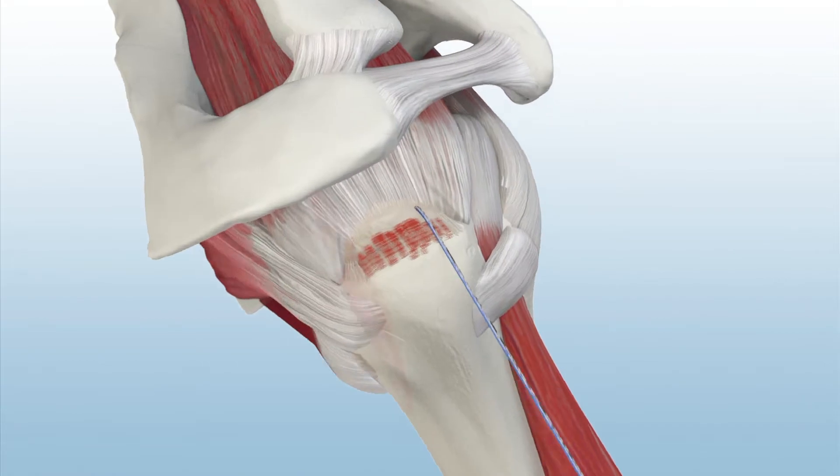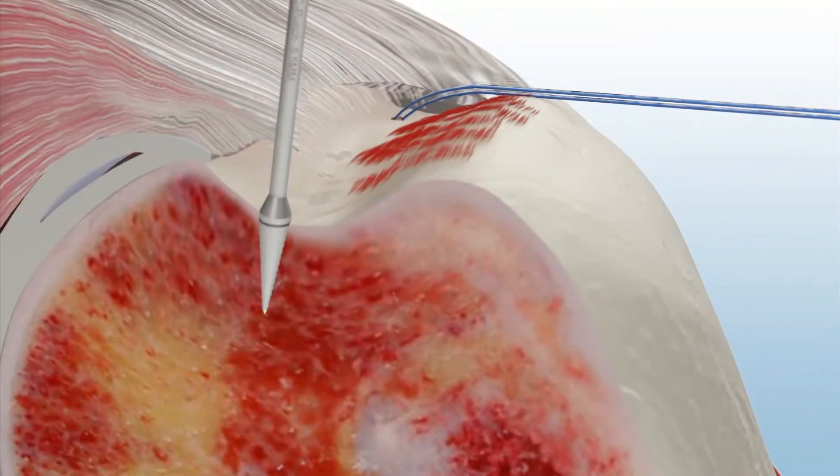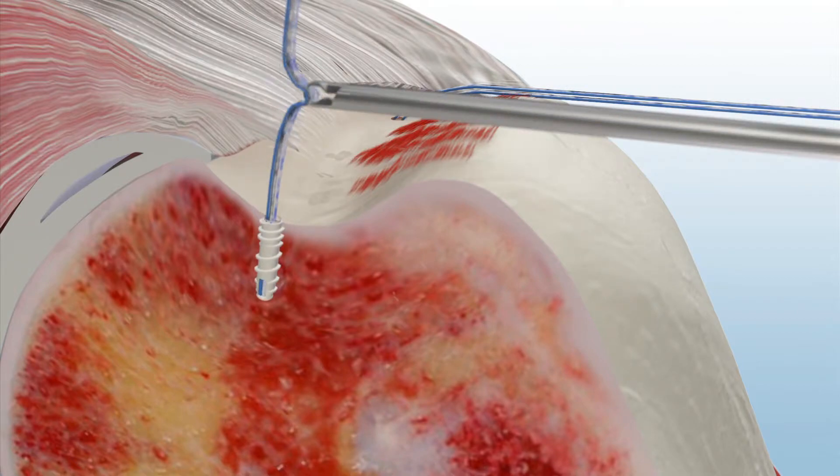A second punch and anchor are inserted. Genesis Biocomposite Material features proven bone growth and exceptional mechanical strength.